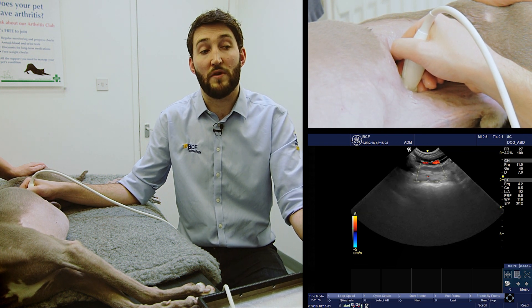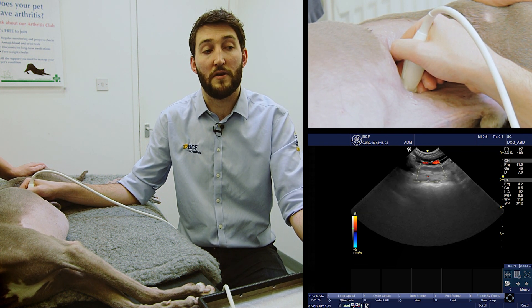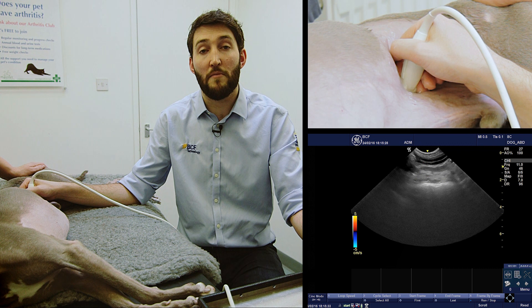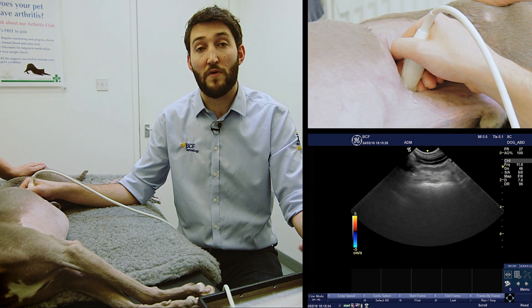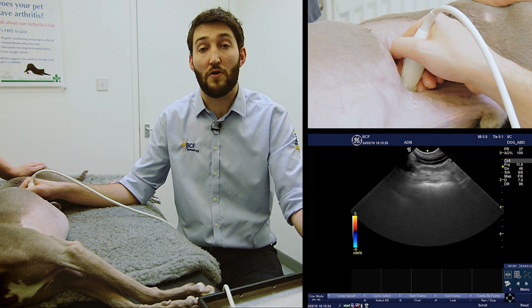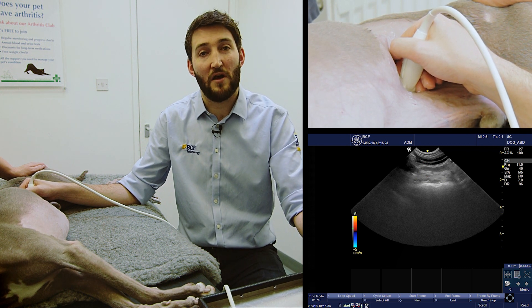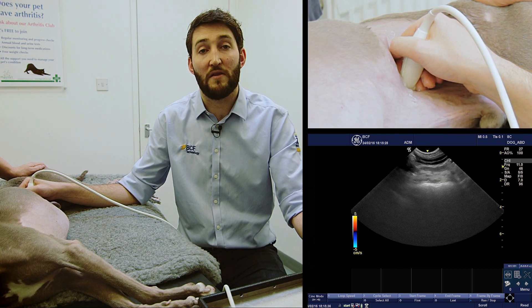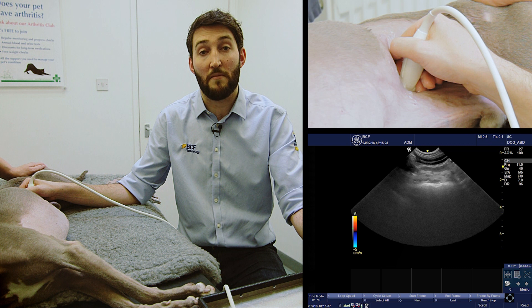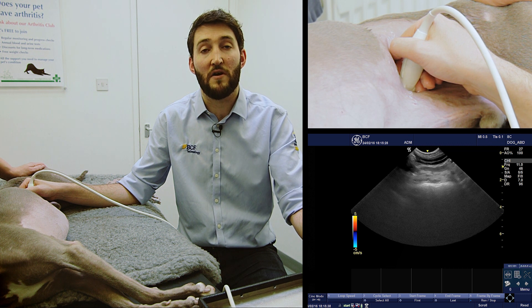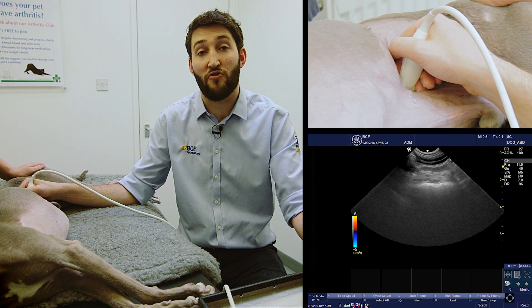Just bear in mind that if you have an obese dog or a relatively basic ultrasound machine, you may find it a lot more tricky to see these structures.